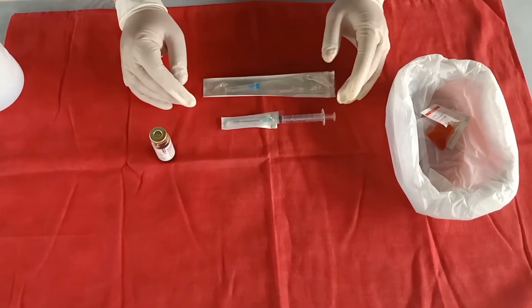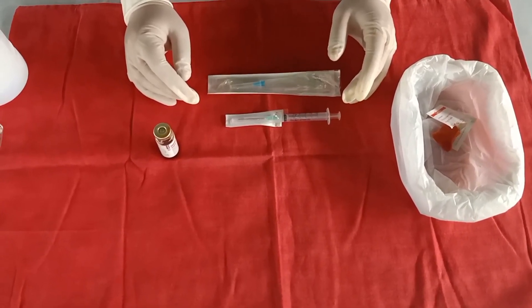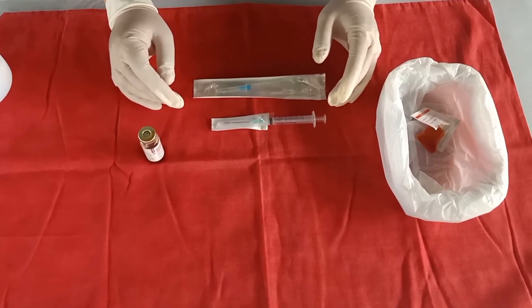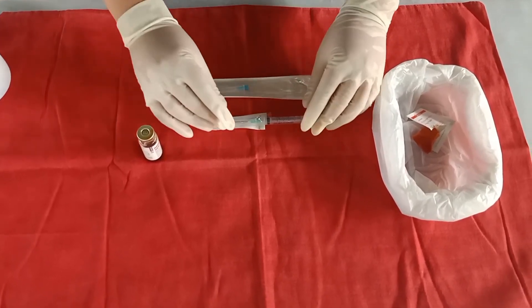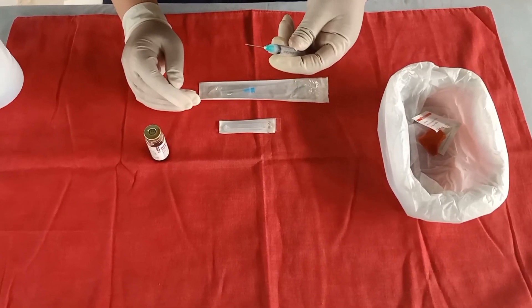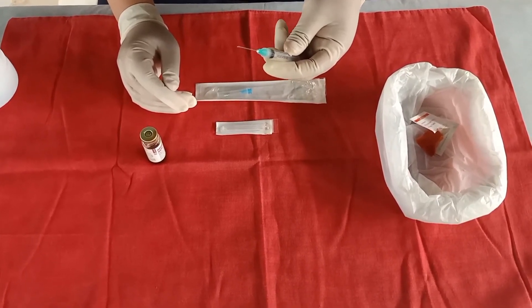Remove the cap from the needle, then draw up into the syringe the amount of air equal to the volume of the medication to be withdrawn. I will be withdrawing 1 cc of the medication.